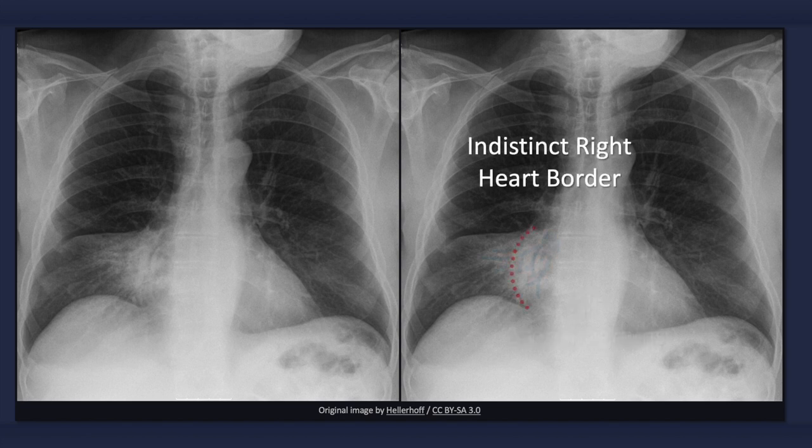Consolidation of the right middle lobe results in effacement of the right heart border, obscuring the interface between the lung and the heart. This is referred to as the silhouette sign.